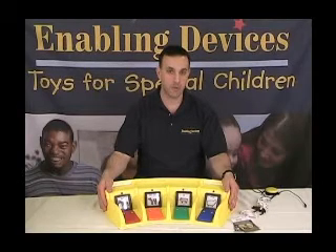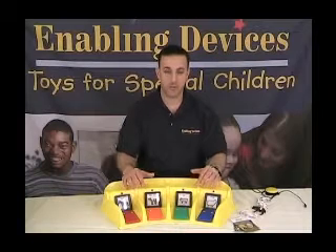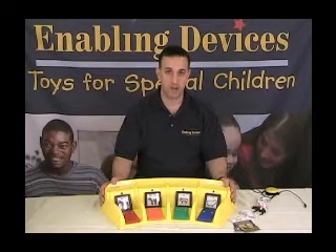We're going to talk about our scanning communicator. This is our super-sized communicator, item number 1221. Keep in mind that the focus of today's video is regarding the scanning functions only — we're not doing a complete overview of the product. We really just want to focus on scanning, as we get a lot of questions asked about it.